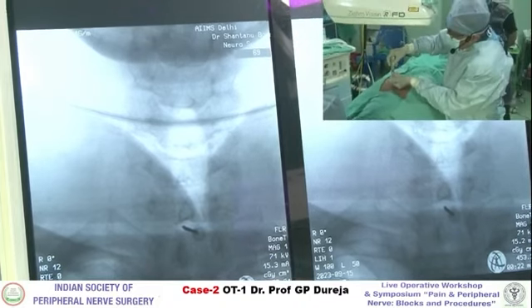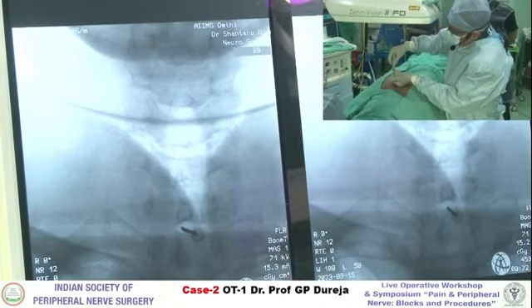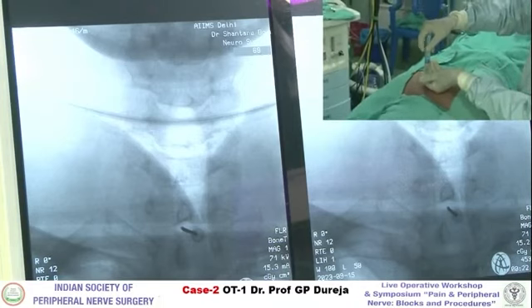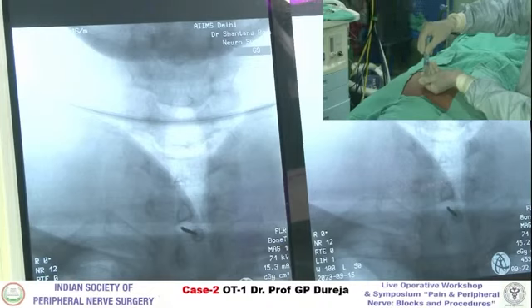This is slightly... this is exactly in the midline, no, sir? It is going from the midline, but to the left paravertebral. Yes, sir. From the midline, and you are going on the left side. Yes. Okay, sir. This is not a paramedian, so I am just gently pushing the plunger. Now I have reached the ligamentum flavum. But even if you are in midline, still it can go. The drug can still go. Yes, it can. Yes, sir.